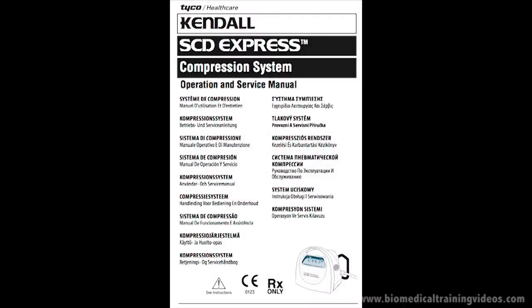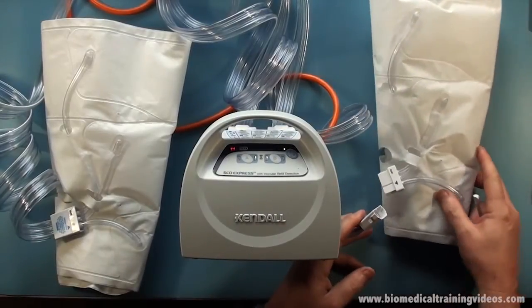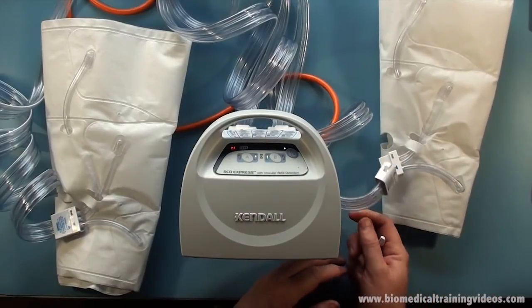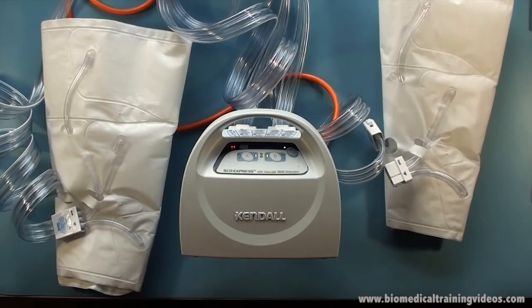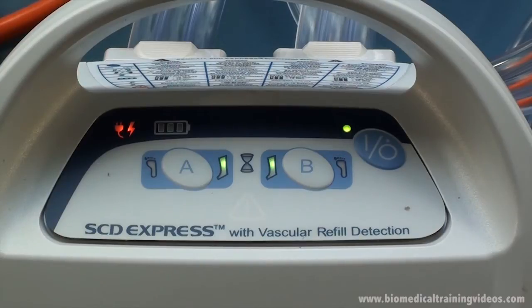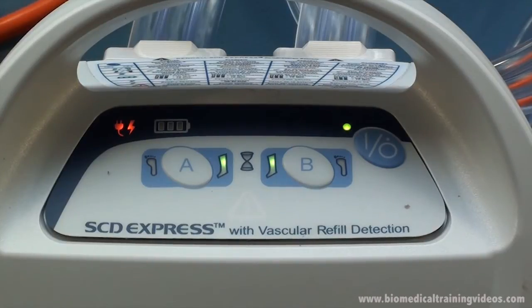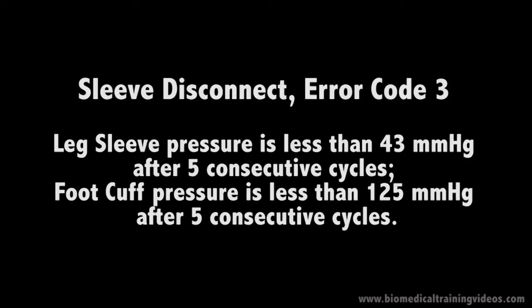We are going to make reference to the service manual. In the first part, we are going to demonstrate the sleeve disconnect. If you unplug one of the sleeves, you don't immediately get an error to indicate there's a leak. In fact, it takes 5 consecutive cycles before an error code 3 is generated.